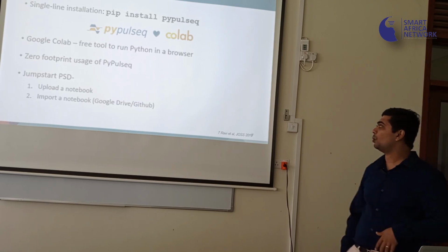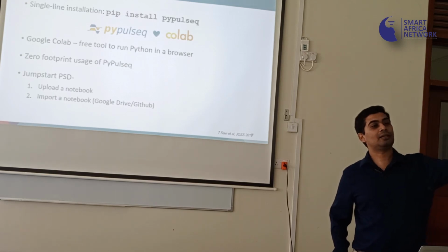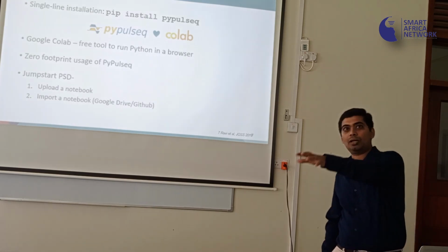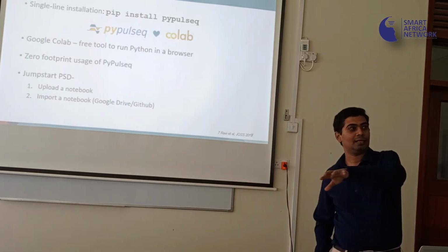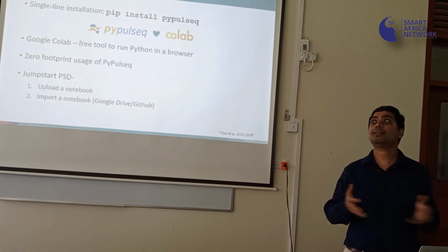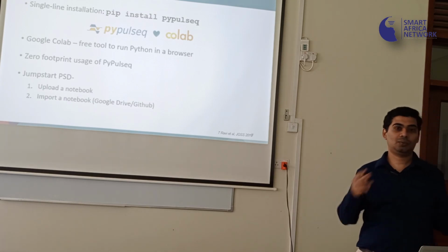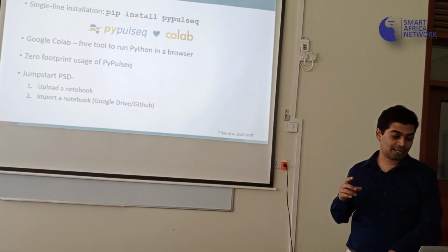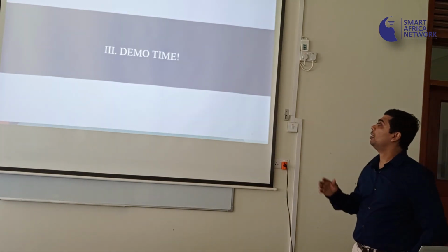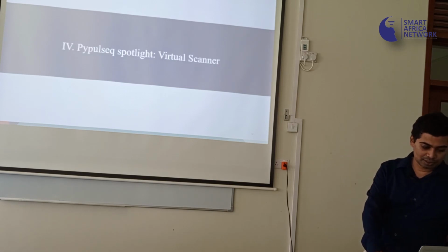You can upload a sequence, import a sequence. That's the best thing about it. If somebody on this side was developing a sequence and you wanted folks from the other side to look at it or refine it or use it, it's exactly the same as a Google Doc. You can collaboratively make these sequences, edit these sequences and play these sequences. So I'm excited by the prospect of doing this in a collaborative setup. This was the demo. I will skip this for now, but I'm happy to do this next.